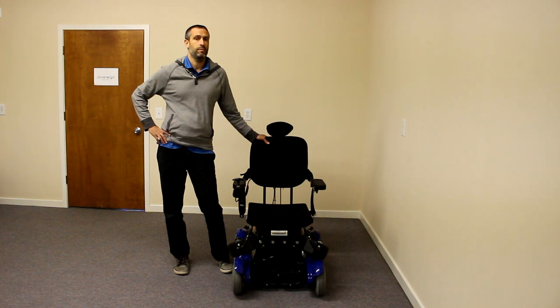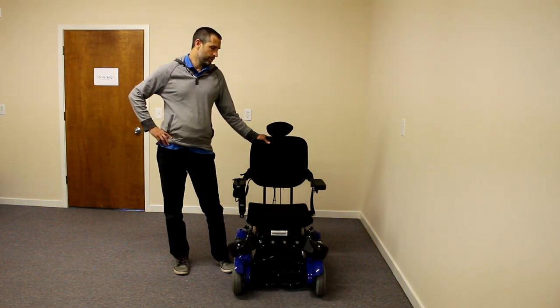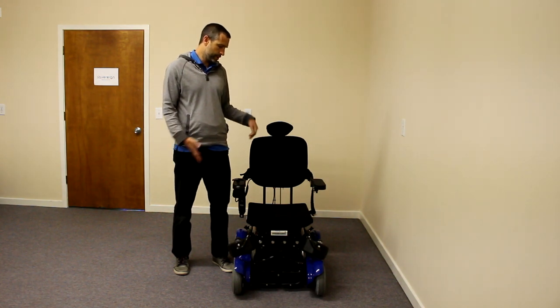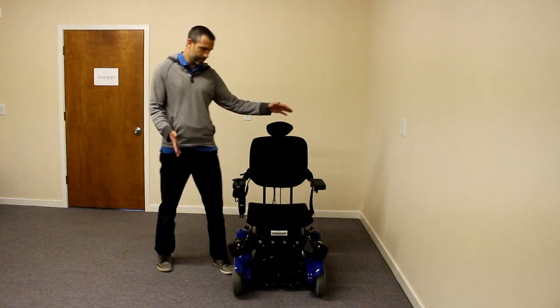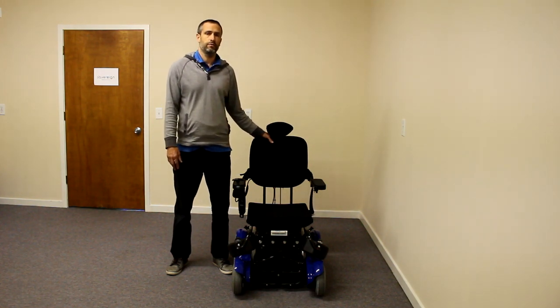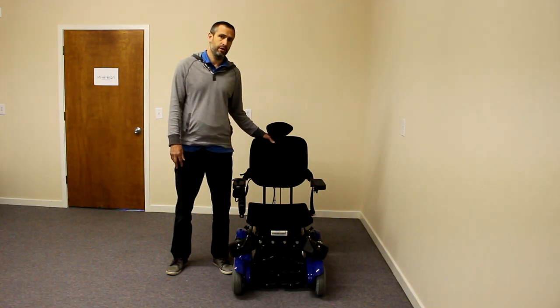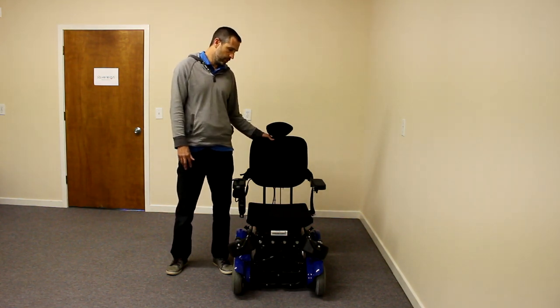The 12.5-inch seat pan is the smallest I know of, so you can fit small children in this chair — it definitely has a purpose in the pediatric market. You can get down to a 13.75-inch seat depth, so you can fit a pretty narrow, not-so-tall person in the chair. The seat pan has built-in growth for width and depth, making it easy to grow with the child, or to change seat width or depth if the chair goes from one person to another.